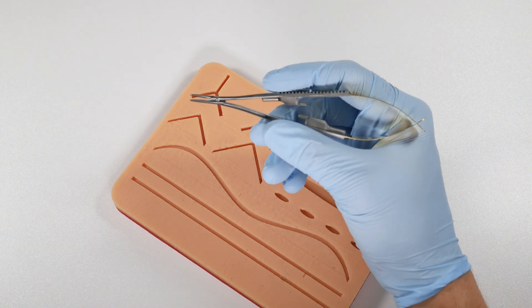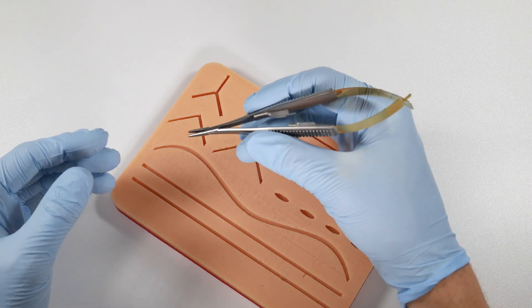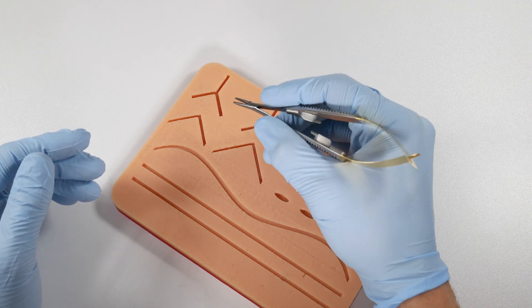The other thing about it is you typically would hold it like a pen, just like this. It's smaller in the hand and allows you way more dexterity. You can look at how you can control this once you've got the needle in there—it's pretty amazing.